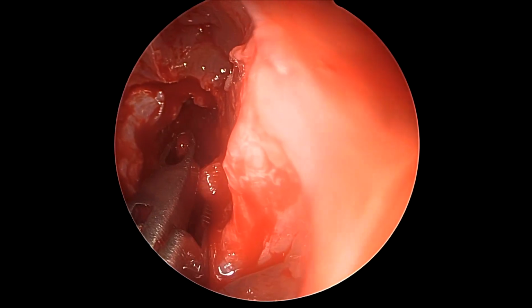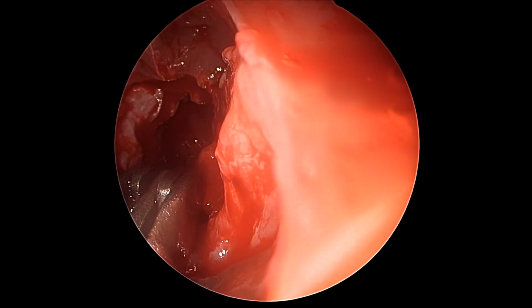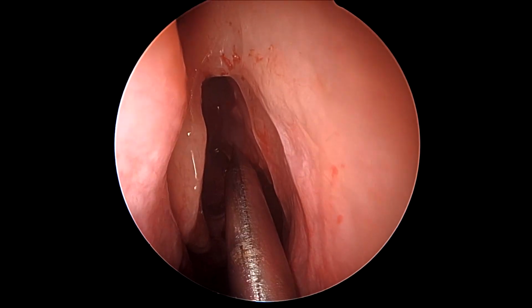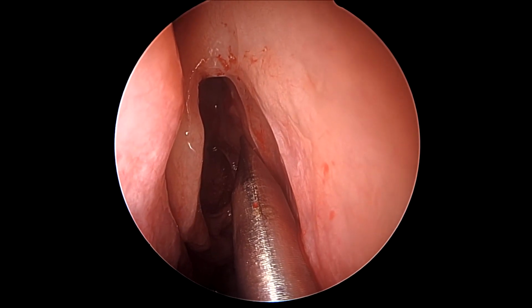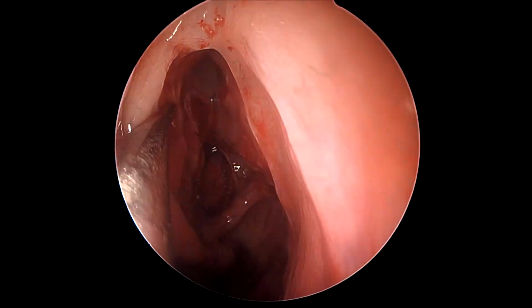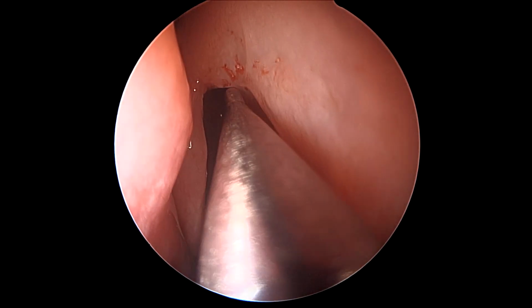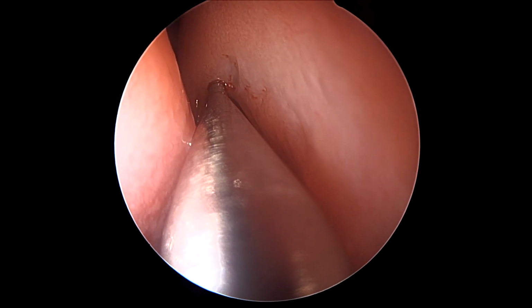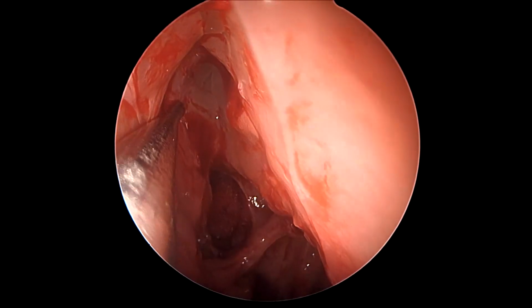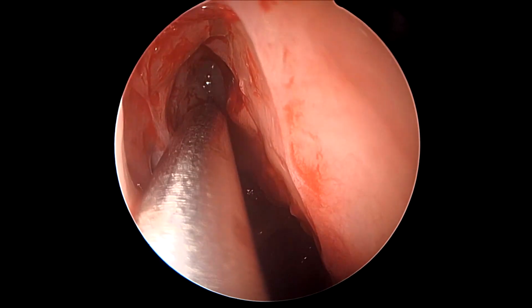Once again, any excess mucosa that incidentally or accidentally gets slightly avulsed should be trimmed using either a shaver blade or a straight true cut forceps. Once again, from time to time, we keep using the navigator probe to make sure that we have minimal tracking errors, so that once we come to the more important parts, the tracker does not overshoot or undershoot.